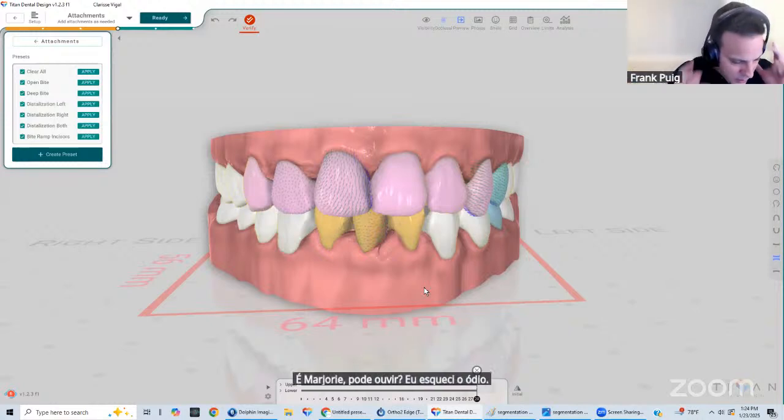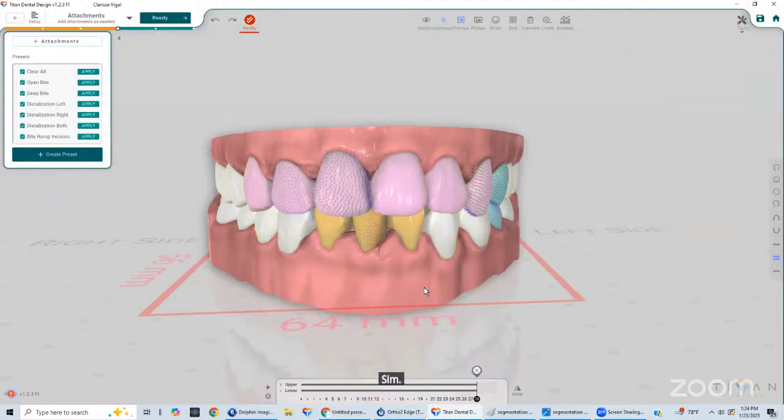So the radiation dose and the point that I'm trying to make is this is an unbelievable opportunity for teaching, and the only way that we are going to bring more and more people to Titan is by teaching case by case, and people have to do one case, and that has to be kind of a certification, levels of certification for Titan, because doing one case doesn't mean that you can do it.